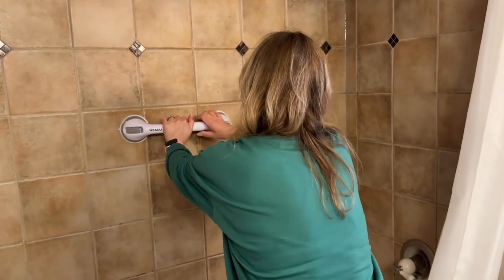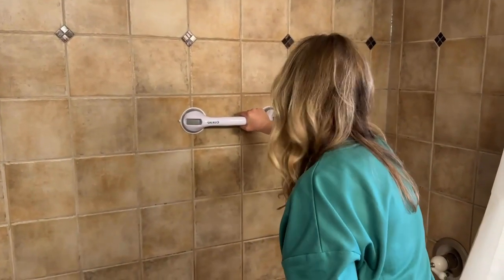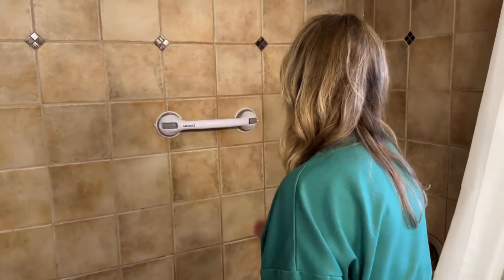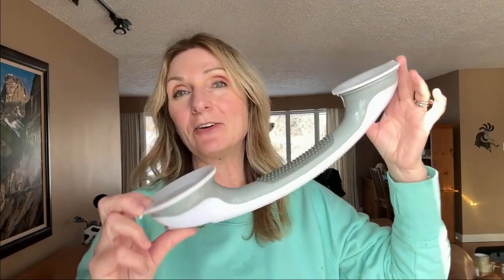Here it is on the shower tile. It is perfect for getting in and out of the bath when you just need that extra hand to help you stand up and get out of the tub. Super easy to take off — you just clip those off and it un-suctions. Definitely highly suggest this for anyone looking for that extra help when getting in or out of the tub.